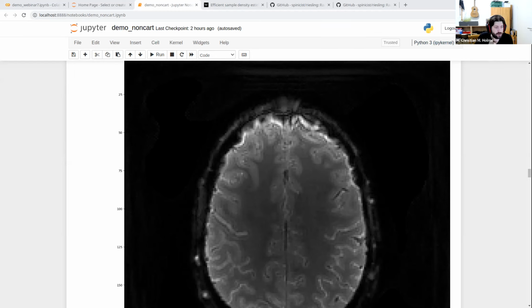I would need to check with my colleagues who have done a lot more flow imaging than me. But if I understand them correctly, yes, at least for the two images from which you want to compute the phase difference, you will need to have the same coil sensitivity profiles. So if you're using reference encoding, you need to do that. The things where you do a phase difference need the same coil sensitivity profile. Okay, thank you.